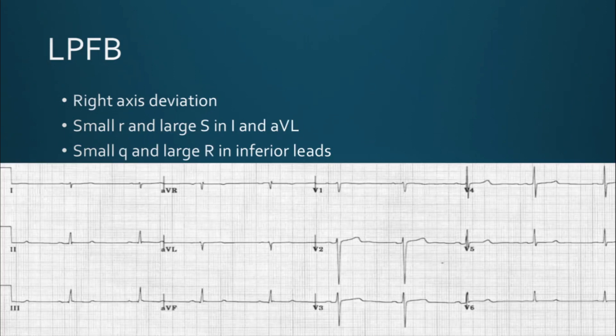The left posterior fascicular block is the exact opposite. You will have right axis deviation: lead I is down, lead AVF is up — your thumbs are heading toward each other, so that's right axis deviation. You'll have a small R wave and large S wave in leads I and AVL, and a small Q wave with a large R wave in the inferior leads. You can see small R, larger S in I and AVL, and a small Q wave with large R waves in the inferior leads. That's your left posterior fascicular block.